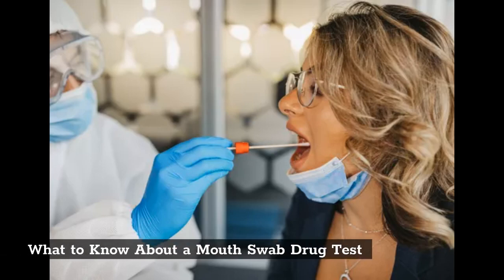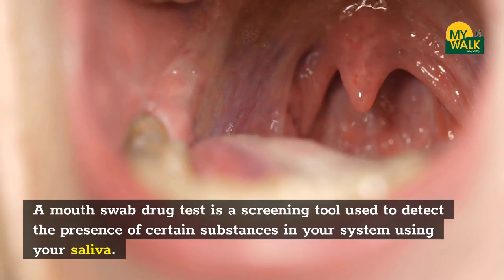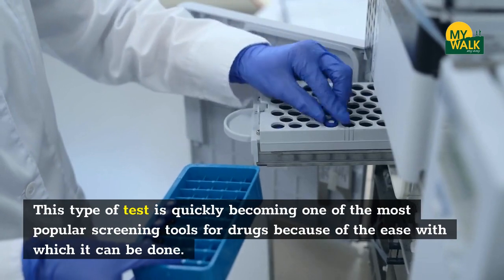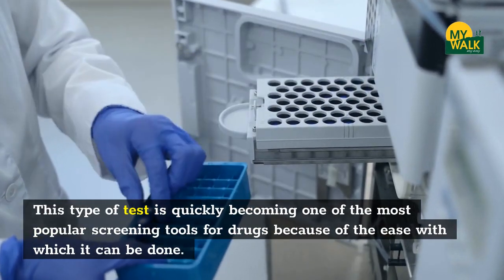What to know about a mouth swab drug test. A mouth swab drug test is a screening tool used to detect the presence of certain substances in your system using your saliva. This type of test is quickly becoming one of the most popular screening tools for drugs because of the ease with which it can be done.